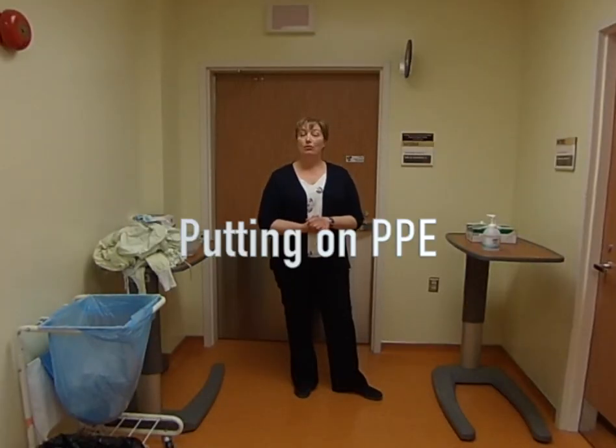Let me show you how to put on the different types of PPE including the gown, eye protection, mask, and gloves, and then we'll have the opportunity to practice it. So now I'm going to demonstrate how we go about putting on our personal protective equipment.